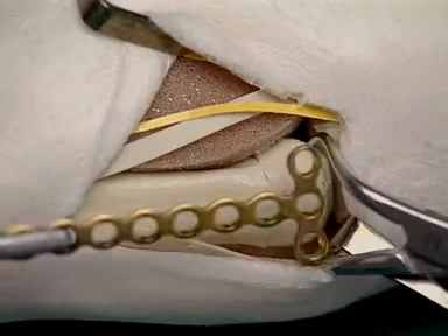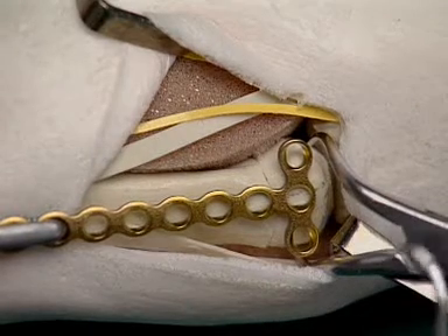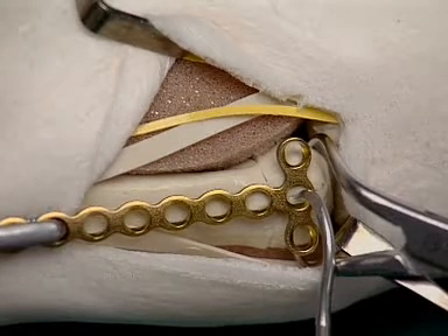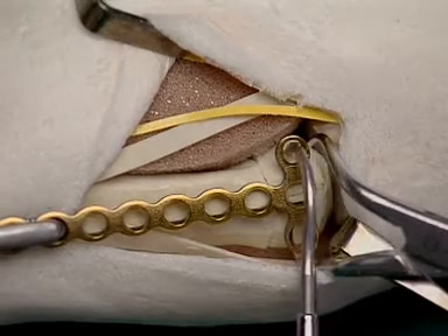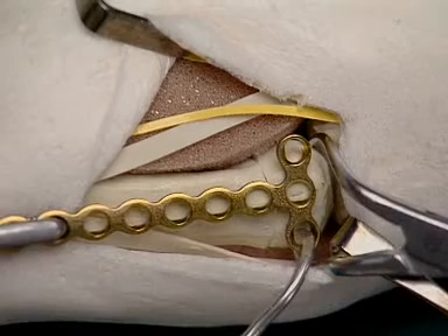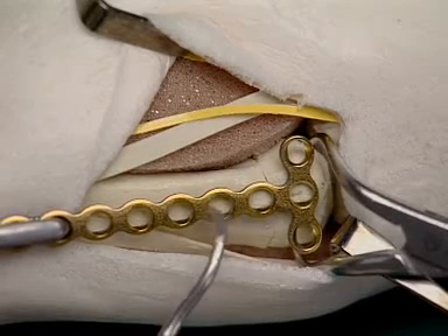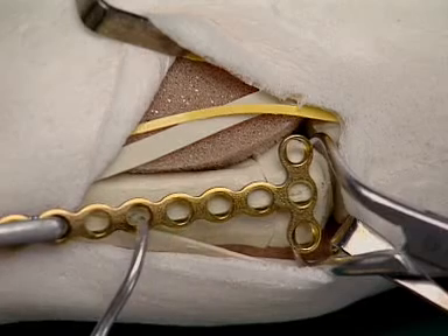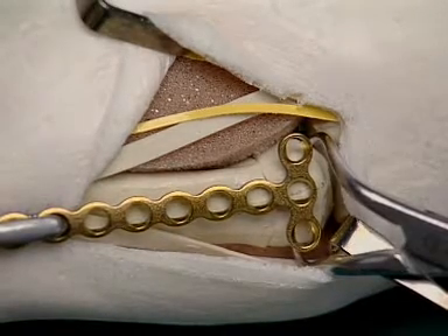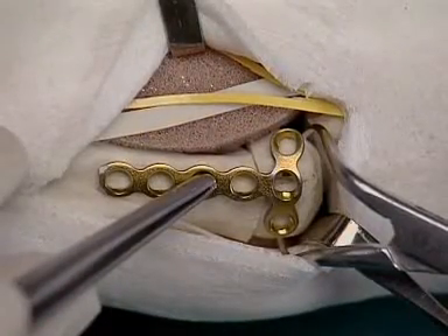A 2.0T adaption plate is used for the definitive stabilization. The central hole in the transverse arm of the plate is positioned over the fracture site, so that one screw can be placed in each joint fragment. The plate must be fixed to the shaft fragment with three screws, the hole nearest the fracture remaining empty. The plate is shortened and contoured accordingly.